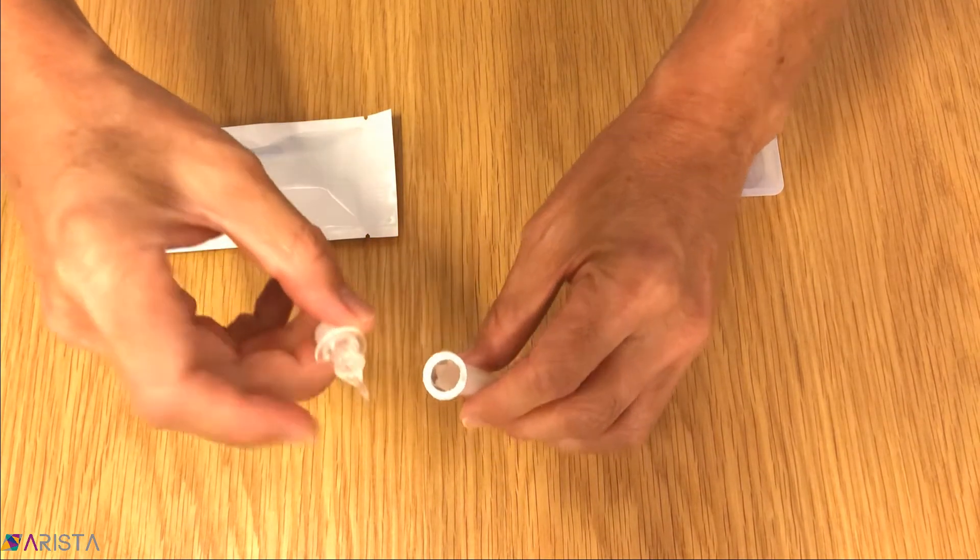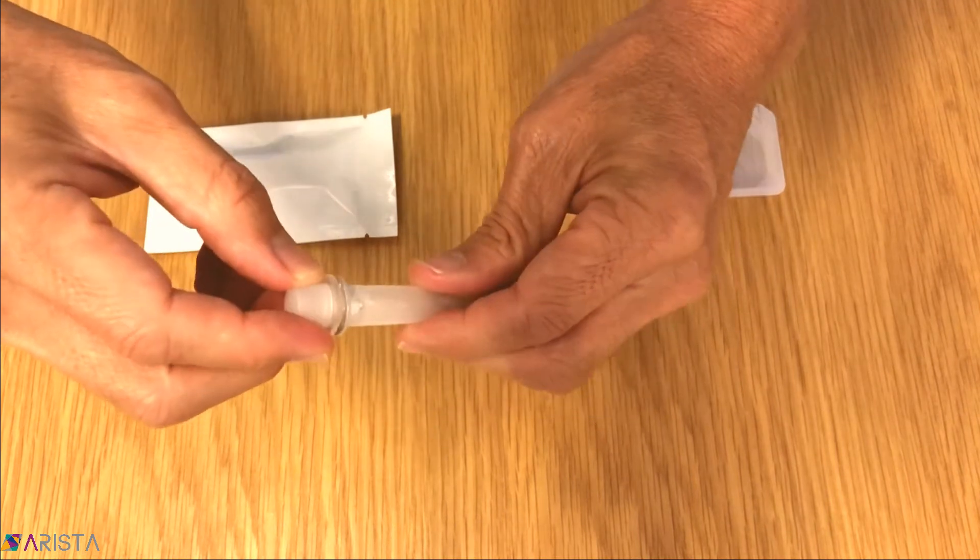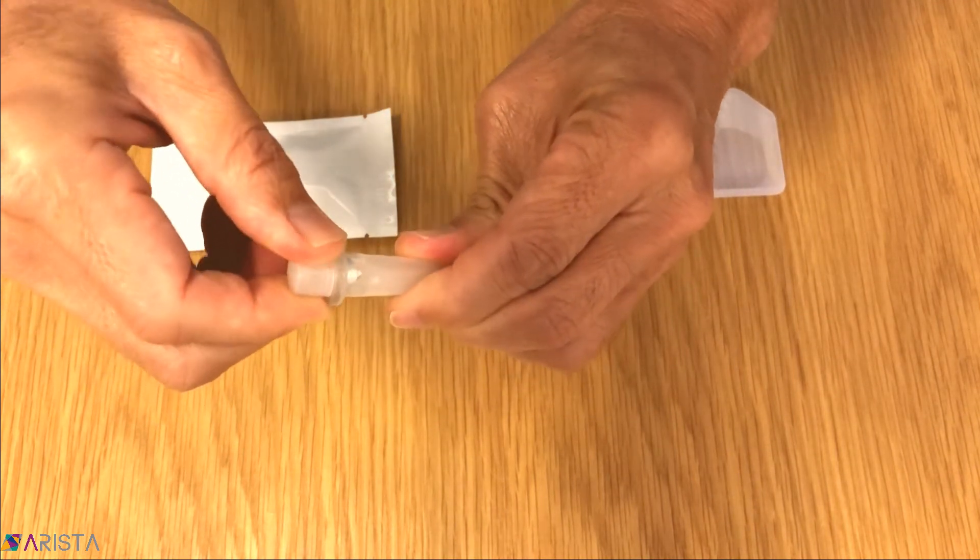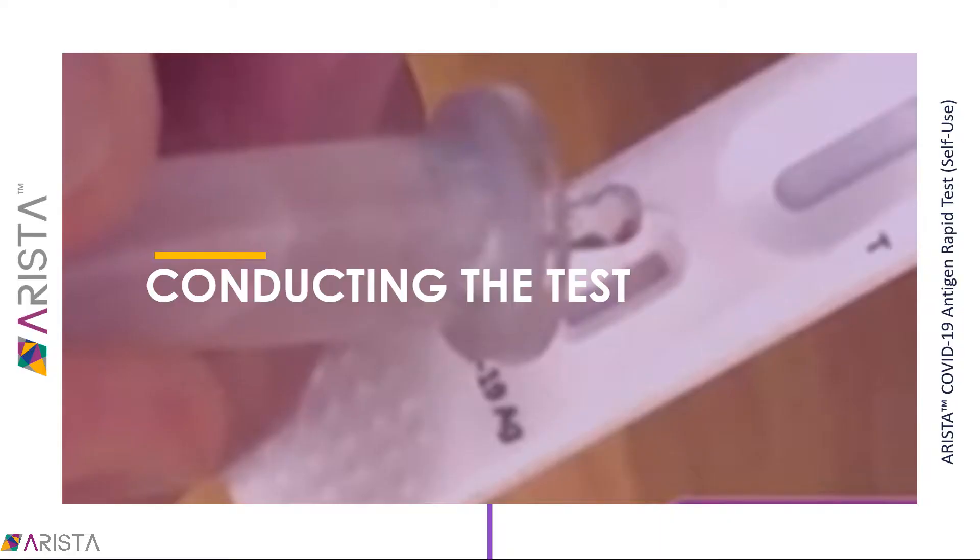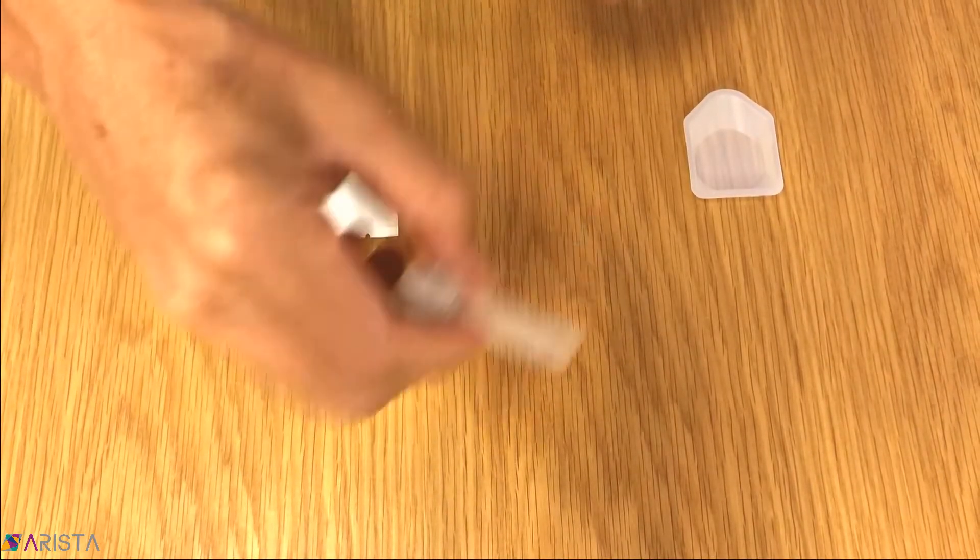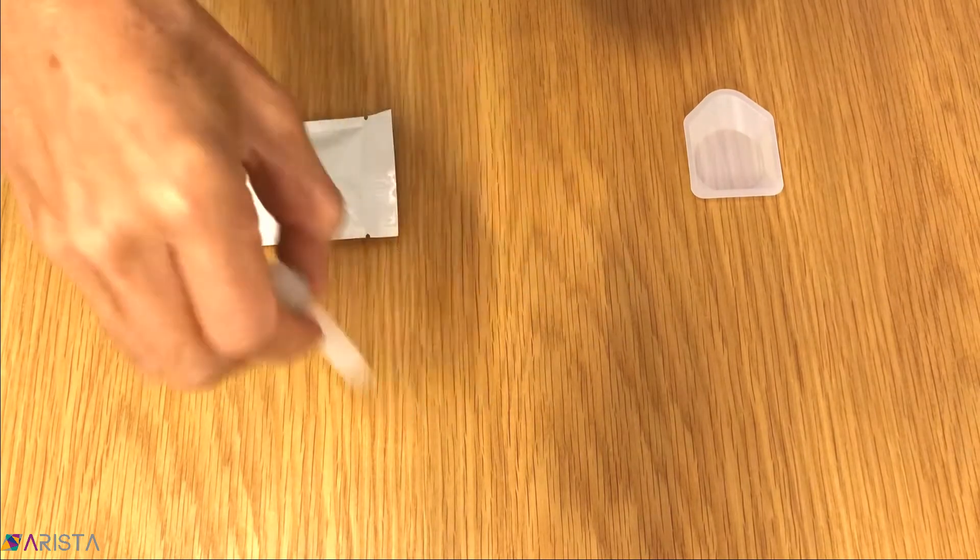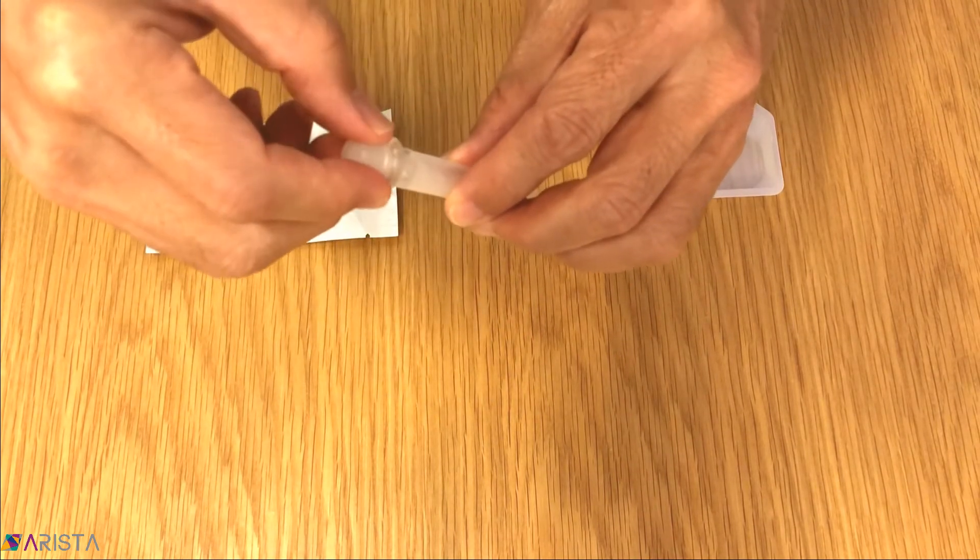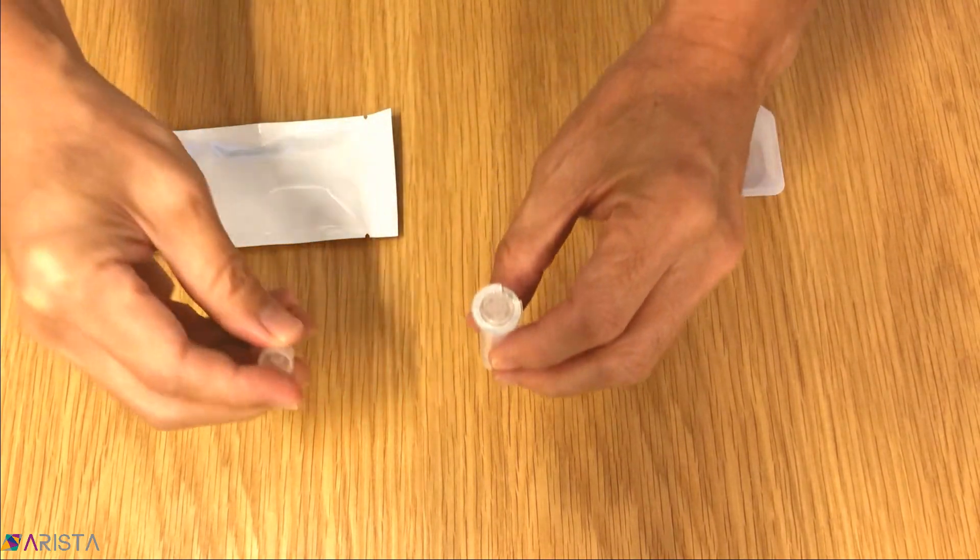Hold the dropper by the protective cap and insert the long pointed end into the tube until it is securely fitted. Gently mix the sample again by rotating the tube for five seconds in a stirring motion. Then remove the protective cap from the dropper.